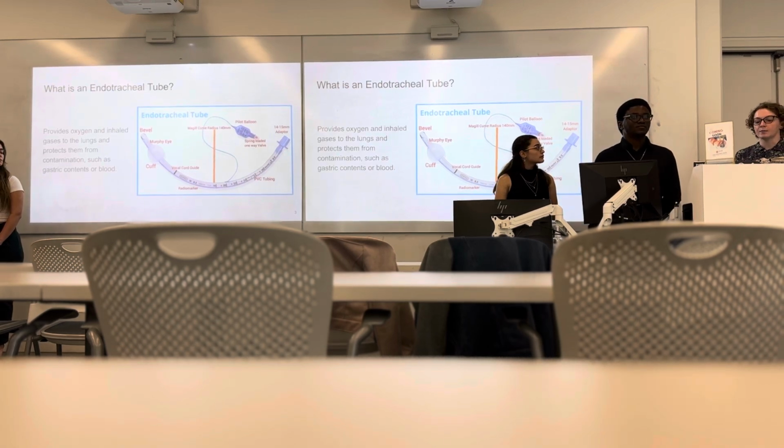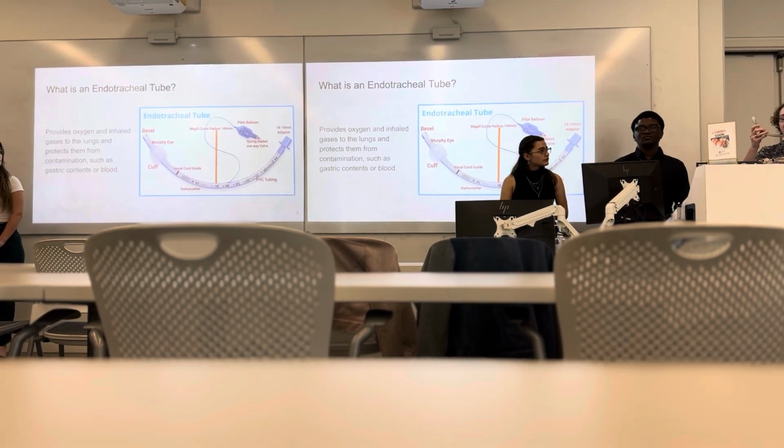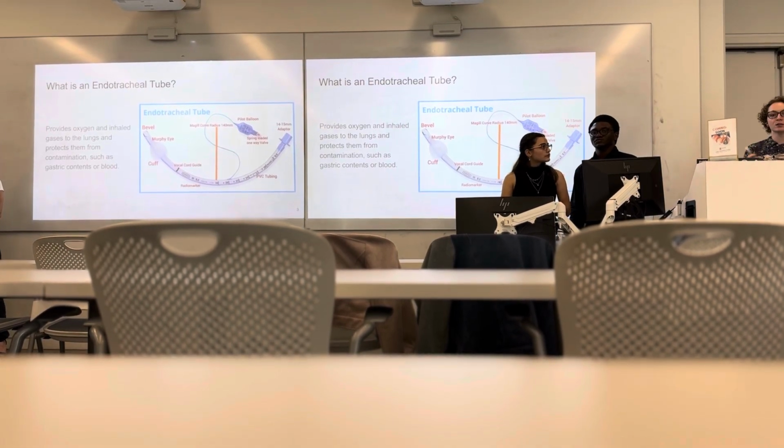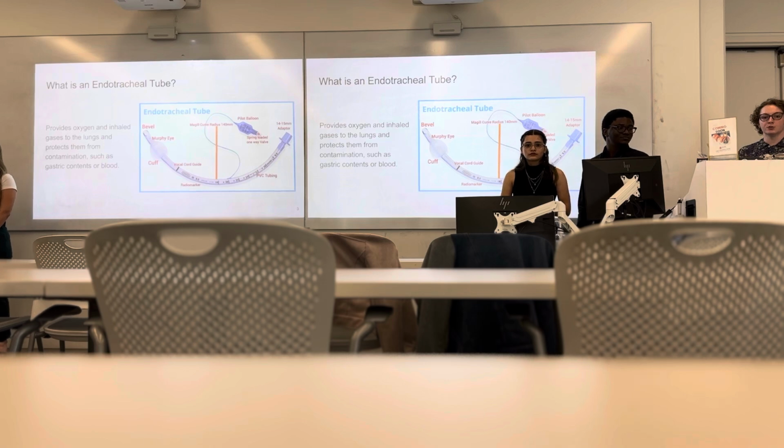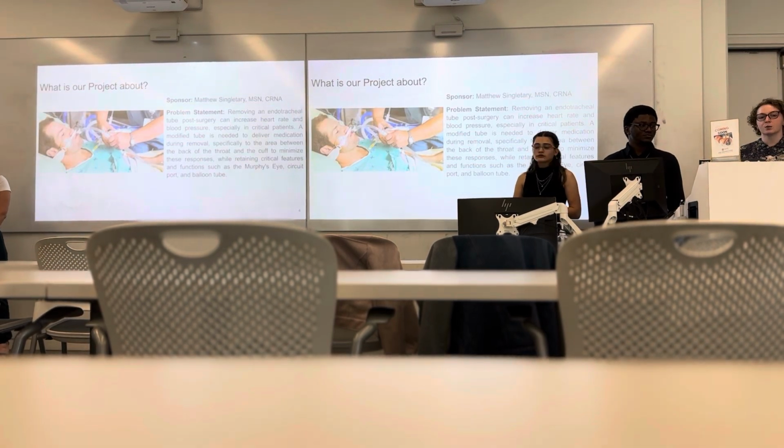lungs. A few key features of an endotracheal tube are the cuff, the Murphy eye, and the ventilator port. You guys all have a standard endotracheal tube that is being passed around, so you can see that during our presentation. So what our project is about.